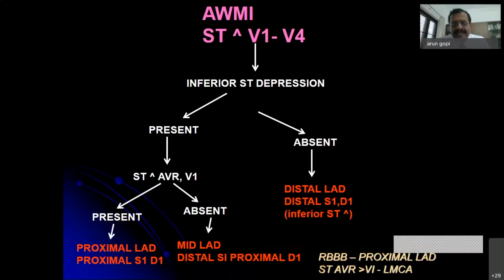When you are seeing a patient with inferior wall myocardial infarction, always look at the rhythm, because most of these patients are complicated by AV blocks, which can be complete heart block to even minor degrees like first degree heart block, as was seen in this case, which had a proximal right coronary artery occlusion, which was opened up by revascularization. In all cases of inferior infarct, it's always prudent to have right-sided leads, that is, leads like V4R and V3R on the right side of the chest. You look for evidence of right ventricular myocardial infarction, which might complicate about 40% of cases of inferior wall myocardial infarction.